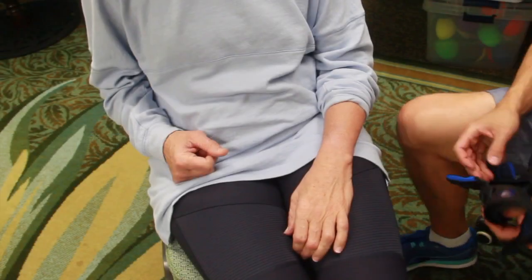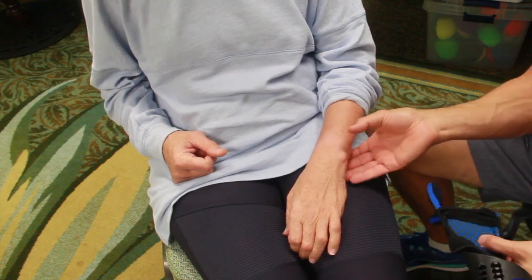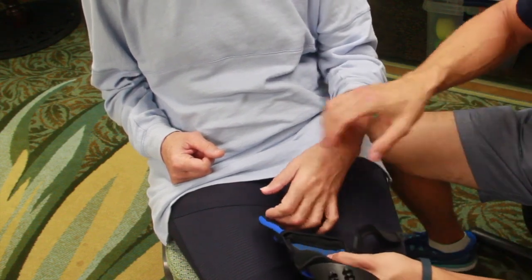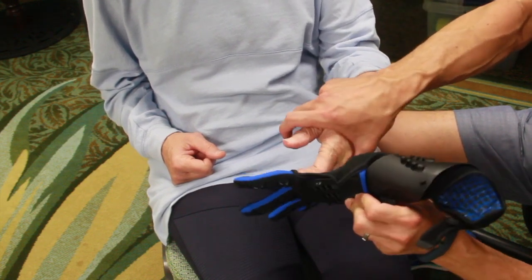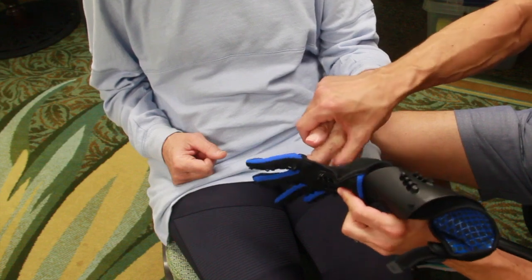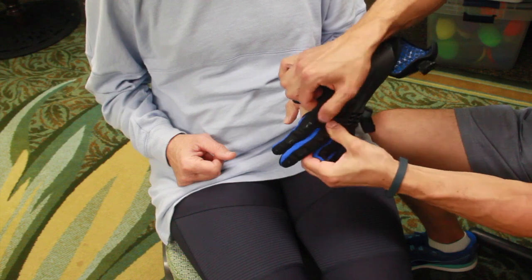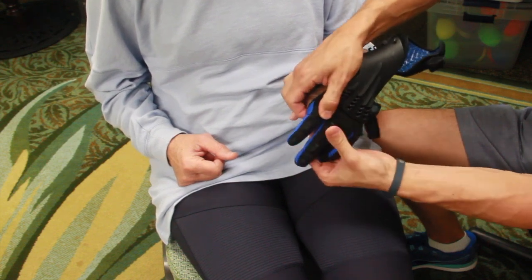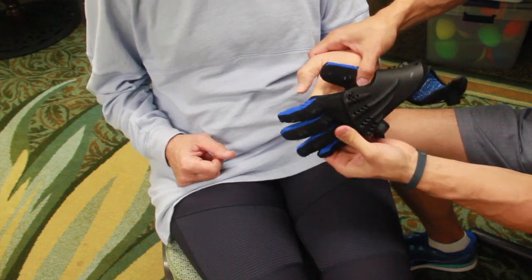Whether you're a caregiver or a therapist, the first step for applying the Saebo Glove is to position the wrist in a bent position so the fingers are nice and loose. As you can see, I moved the thumb sleeve out of the way, put the wrist in a bent position to relax the fingers. And I'm going to then try to slide each finger into the sleeve, starting with the index finger, and just pull on that fabric so the finger's sleeve can ride up the finger of each digit and pull tight, kind of like putting on an isotoner glove.